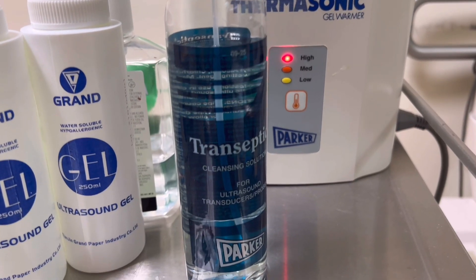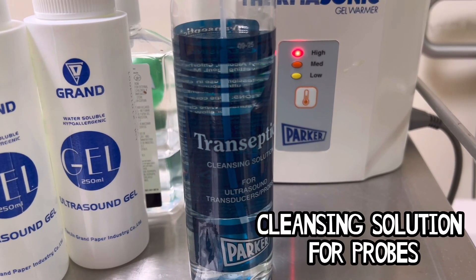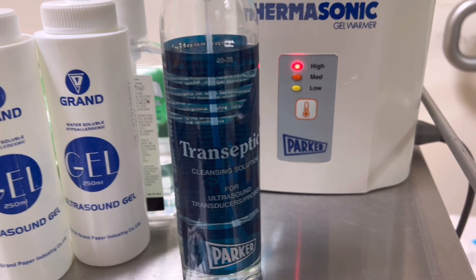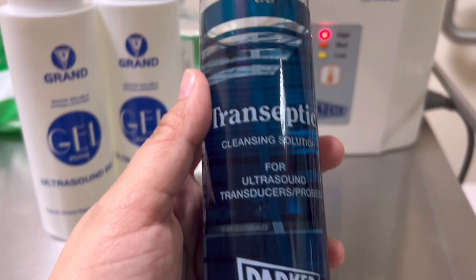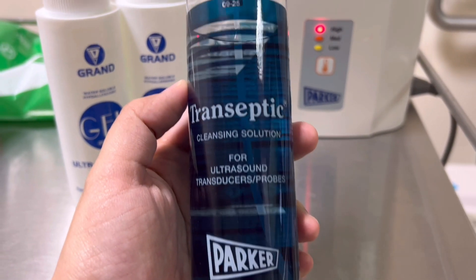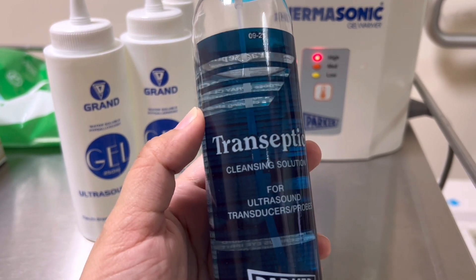Next on our list is the transeptic solution. It is a spray cleaning solution for ultrasound probes that can be used for a variety of purposes. It contains isopropyl alcohol, chlorhexidine gluconate, and a gentle wetting agent. It has the potential to be used as a regular cleanser or as a cleaning step before sterilization.